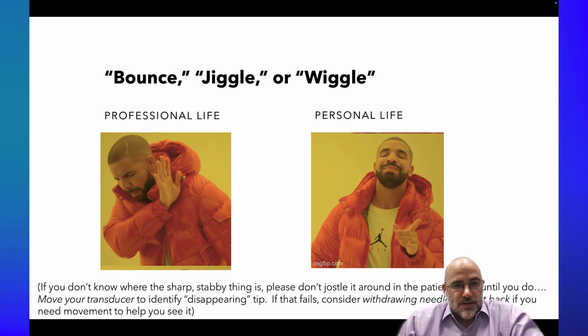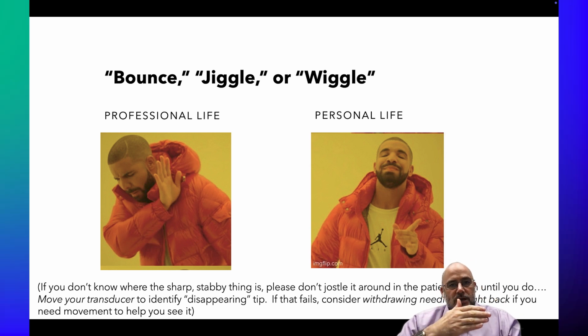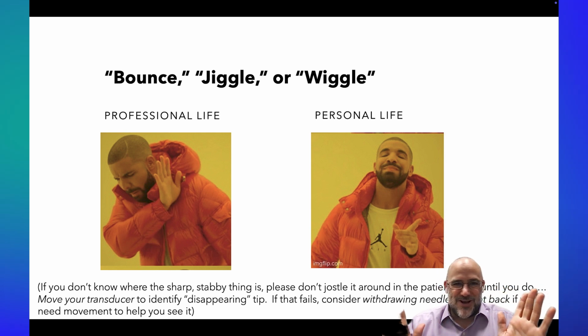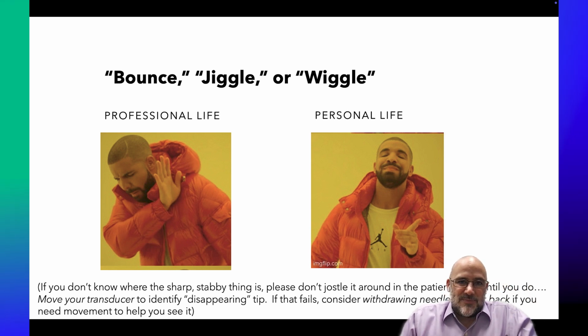So what we'd recommend is, if you're going to use the motion of the needle to determine where your needle is, like which of the things that you're looking at is actually your needle, then go ahead and move the needle back some. Okay. The idea being that any movement that you see, if it's easier to see that movement, great, go ahead and use that. But use that movement in the withdrawing motion, because anything that you've cut or any structures that you've gone through, you've already gone through them. Whereas that kind of bouncing is maybe not the best thing to try. So try that the next time.